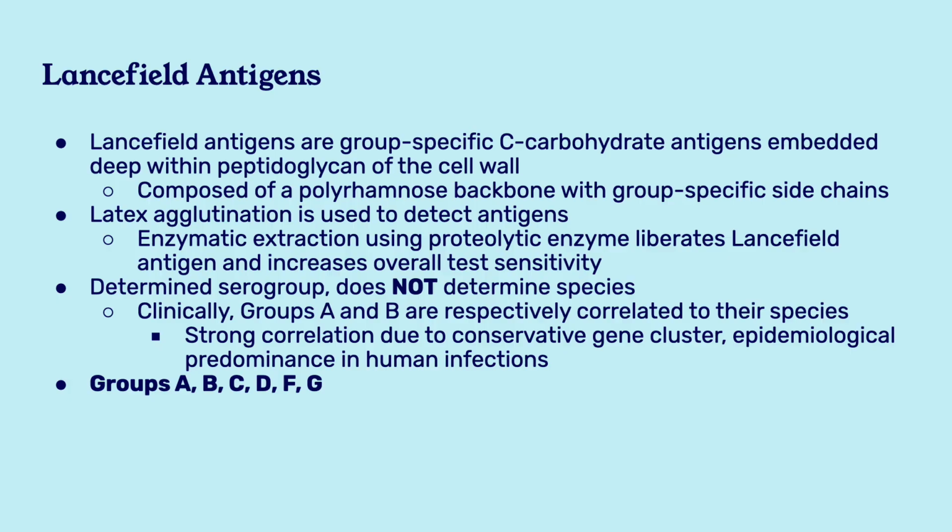It is important to note that Lancefield antigen determines the serogroup, but it does not determine species. However, clinically, groups A and B are respectively correlated to their species due to strong correlation with respect to their conserved gene clusters and epidemiological predominance in human infections. In the clinical laboratory, we test for groups A, B, C, D, F, and G.